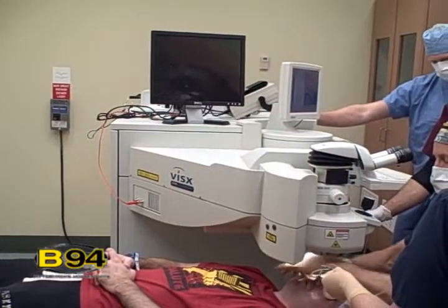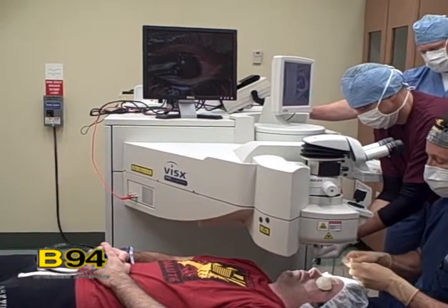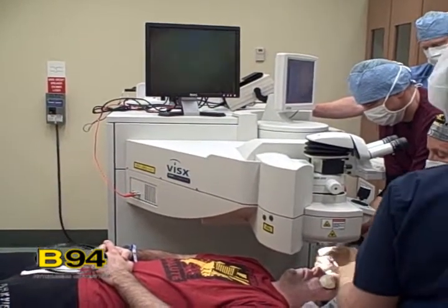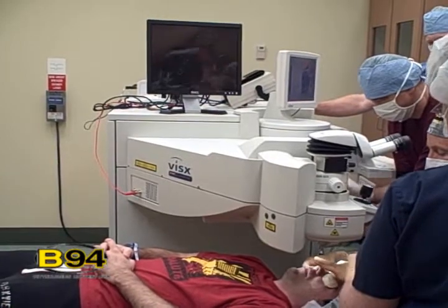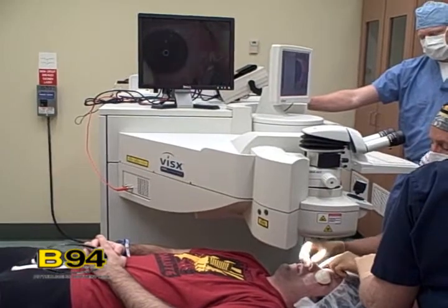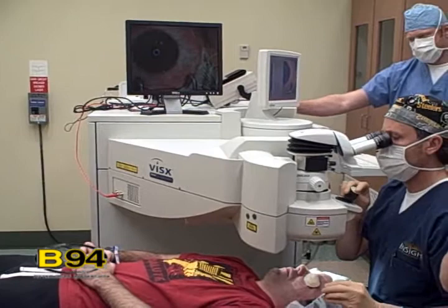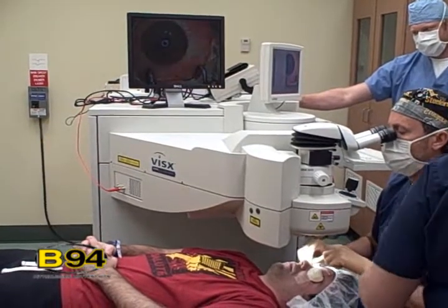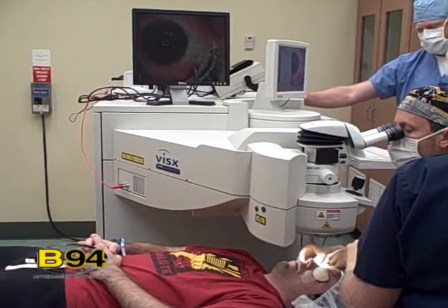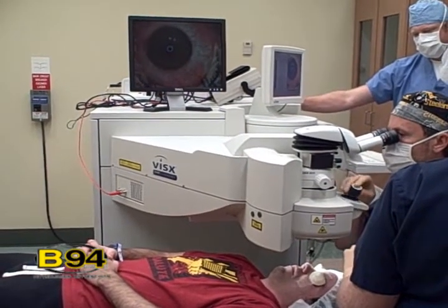What we're going to do is pretty technical, but I'll simplify it. We're basically going to take you into the laser suite. We're going to create this thing called a flap, because LASIK involves using what's called the excimer laser to reshape or reset the curvature of the cornea to correct your nearsightedness. Right now your cornea is actually too steep for the length of your eye, so we're going to make it a little less steep, and that will emulate what you get with your glasses or contacts.